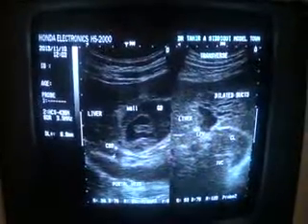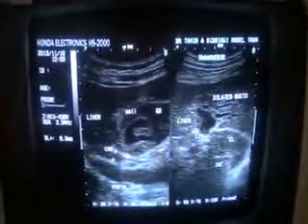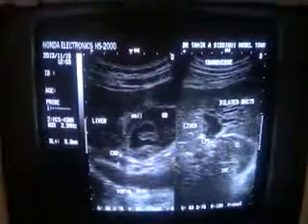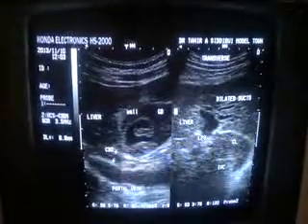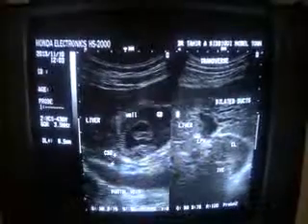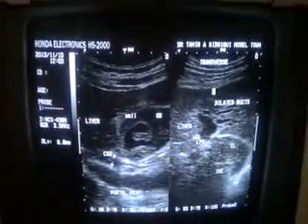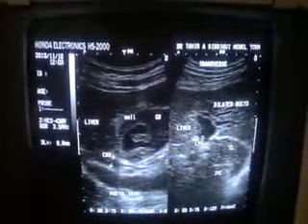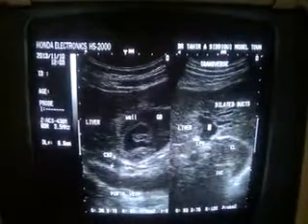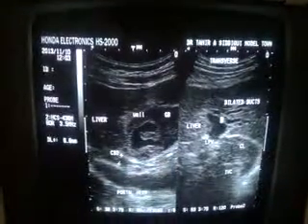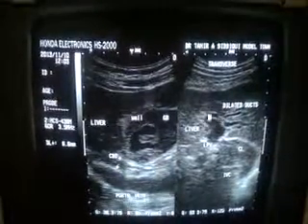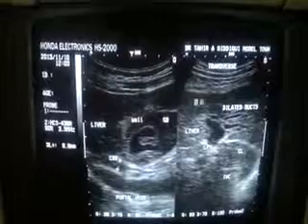This is an ultrasound study of a 60-year-old male. On the image, you can see on the left side of the screen that this is the left portal vein. This is the ascending part of the left portal vein, and this is the right horizontal branch entering the left portal vein. This is the left lobe of the liver in transverse section, and here you can see the dilated bile ducts.